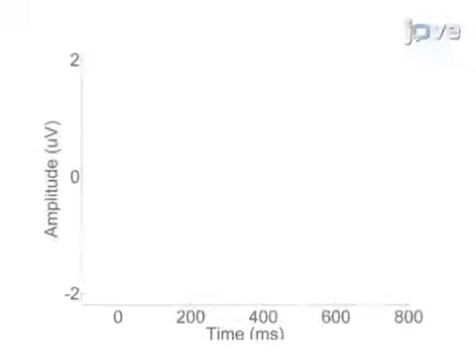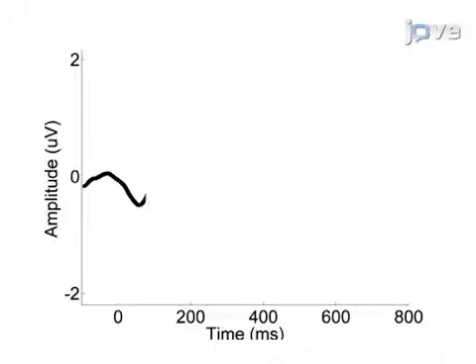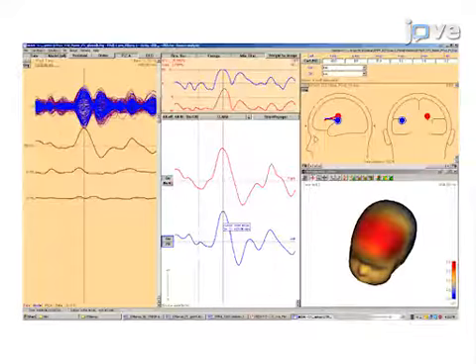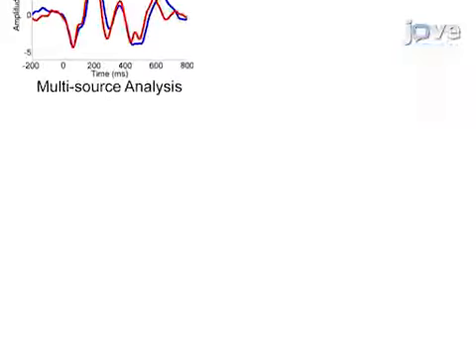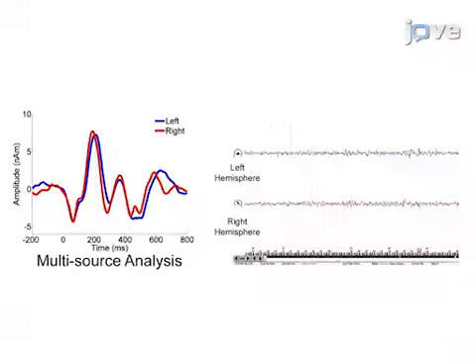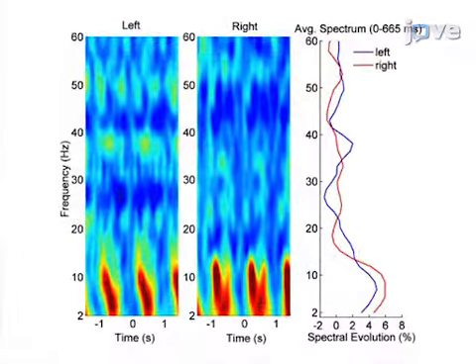The second step is to pre-process the brainwave data to create event-related potentials. Next, perform a discrete multiple source analysis projected onto an age-appropriate infant MRI template. The final step is application of the source montage and decomposition of the signal into the time-frequency domain.